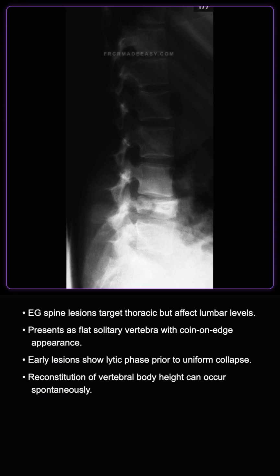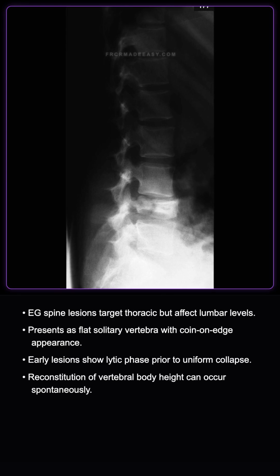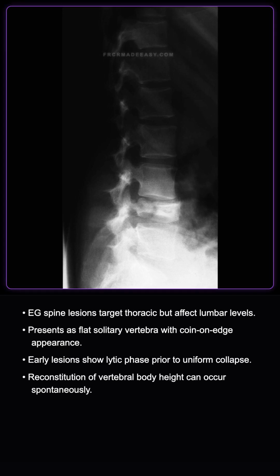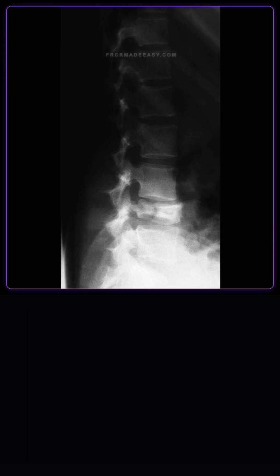During the healing phase, which takes several months to years, there is often partial or near-complete spontaneous reconstitution of the vertebral body height, which is a key differentiating feature from neoplastic collapse. What radiological findings would raise suspicion for a malignant or infectious etiology rather than eosinophilic granuloma?